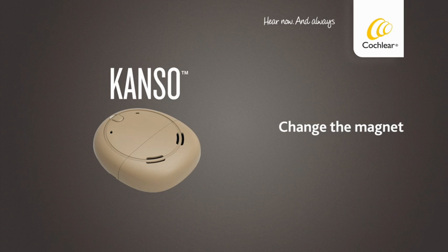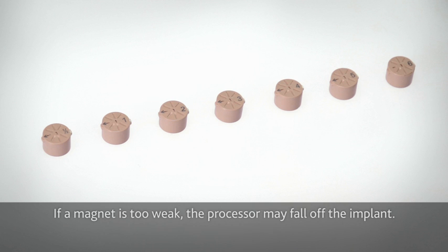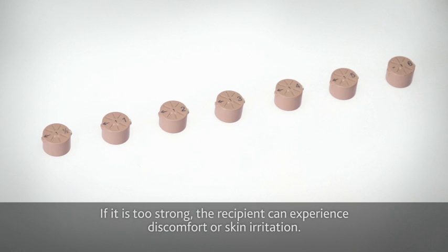Change the magnet. Selecting the magnet strength is key to effective retention of the Kanso sound processor. If a magnet is too weak, the processor may fall off the implant. If it's too strong, the recipient can experience discomfort or skin irritation.